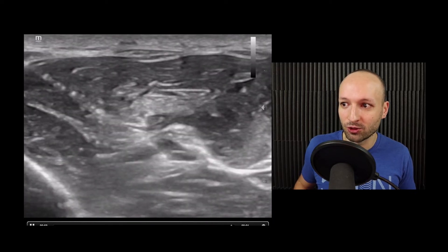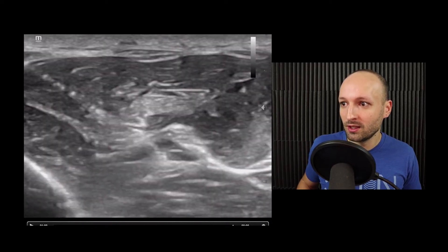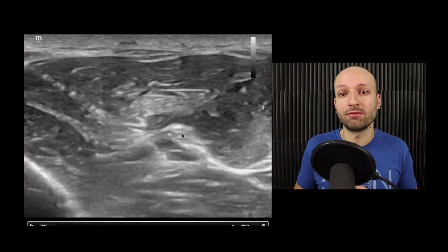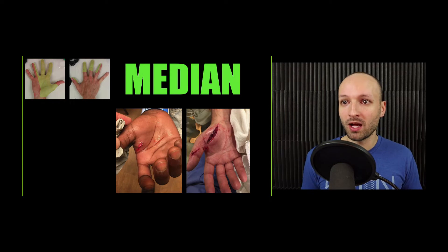Here you can see they're infiltrating the area around the nerve. If we pause at the end, we see a donut around this nerve. Remember, you don't want to get inside the nerve — you want to get in the fascial plane below and above that nerve to surround it. Quick review on median nerve blocks.